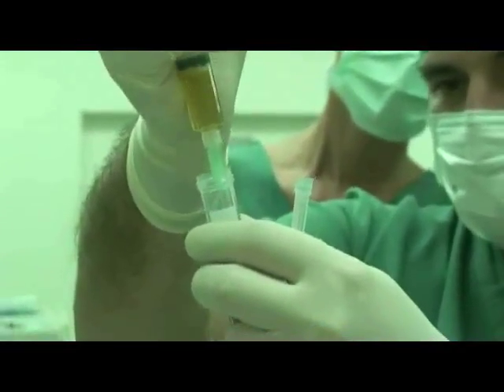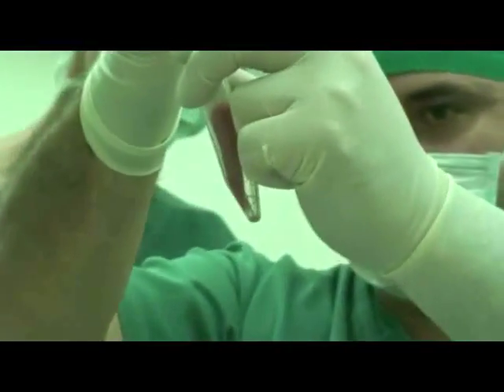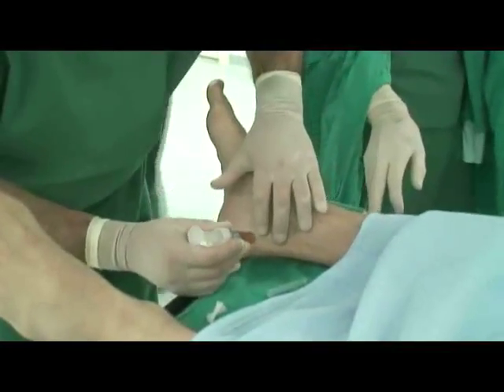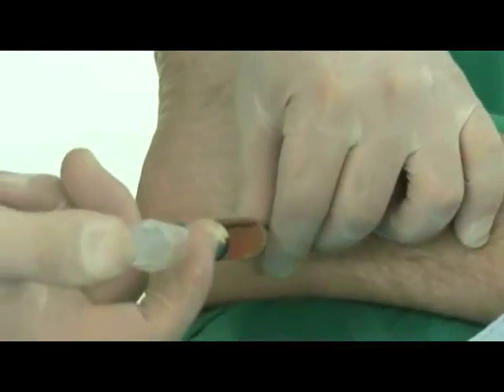The PRP is now ready to use for regenerative medicine applications. The syringe filled with PRP can be injected into the damaged area manually or by using an ultrasound guided technique.